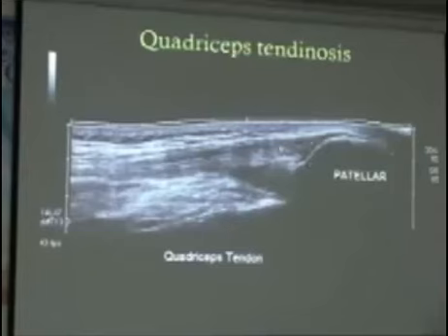The other thing that can commonly occur is you get little tractional enthesophytes, just where the quad tendon inserts onto the patella, and they can be focally tender at that site as well. Khi mình khai cái điểm đau ngay chỗ cái trên xương bánh chè này, mình sẽ tập trung vào trực tiếp vùng gân.